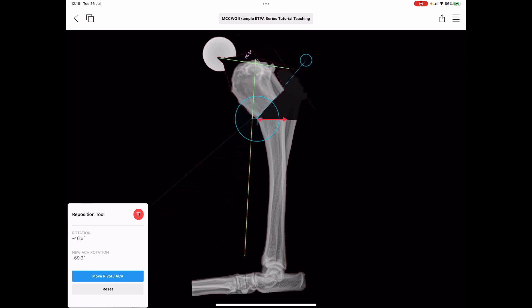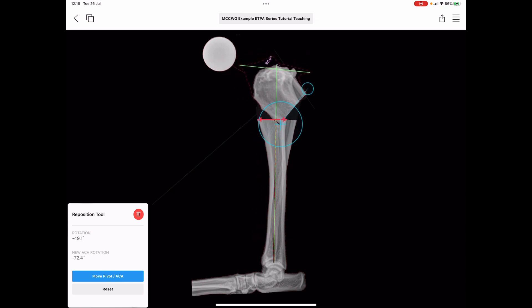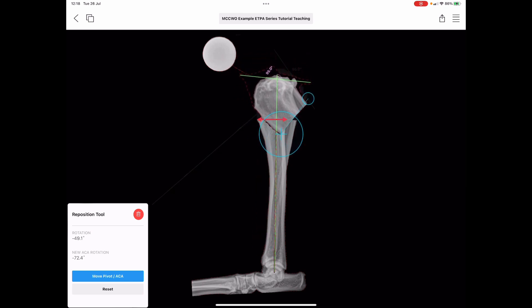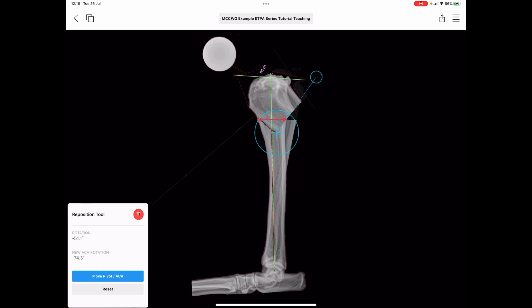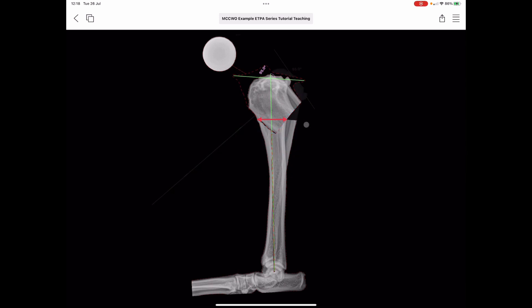We simply realign that proximal fragment with the target mechanical axis — the one we want to pass through the center of the talus. We can move this around until we get a cranial and cortical edge of the proximal fragment that aligns with the osteotomy as defined by the red arrow. Looking more closely, we can see there's an overlap of bone, and the shape of this is the surplus bone stock — it's in the way.